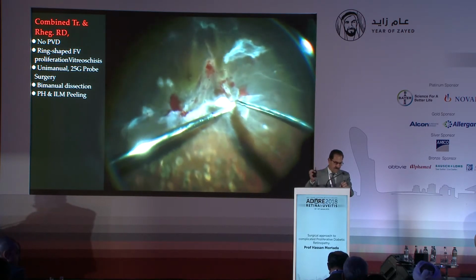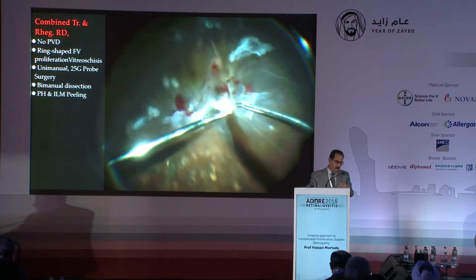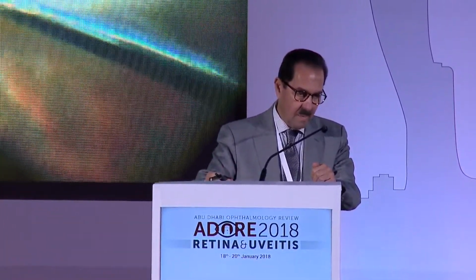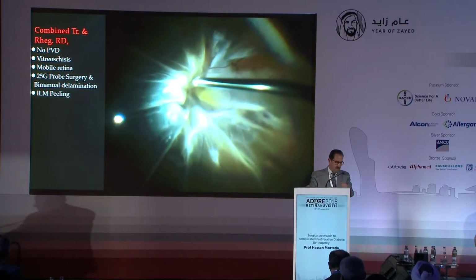And you have to adjust the chandelier light so there will be no reflection and no shadow. And you have to see the epicenters properly and clearly before cutting the epicenter. Sometimes you have to push the retina away to reveal the epicenters, so it is a combination of cutting, pushing the retina and traction with the other instruments until the whole retina is relieved.